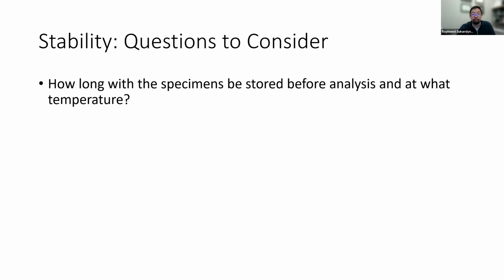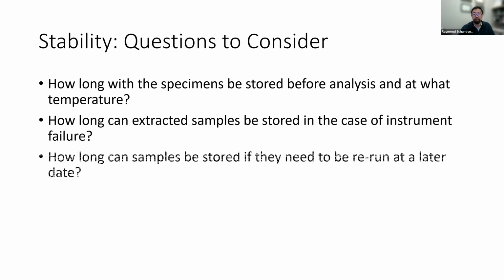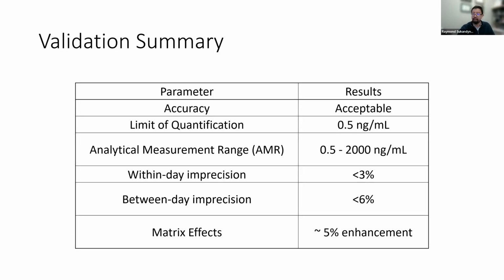So I'll just briefly go over these questions. As I mentioned, at what temperature, and how long will those samples be stored? How long can the extracted samples be stored on the instrument? How long can they be run after, if you have to re-inject them? How many freeze-thaws? That's all coming into play. So that kind of brings us to a head here.